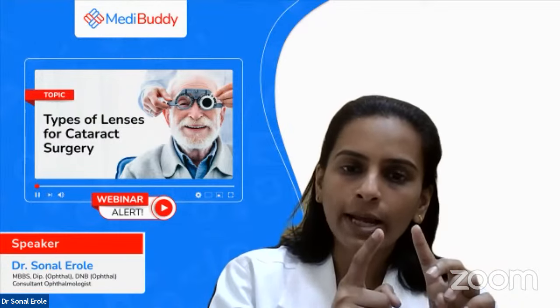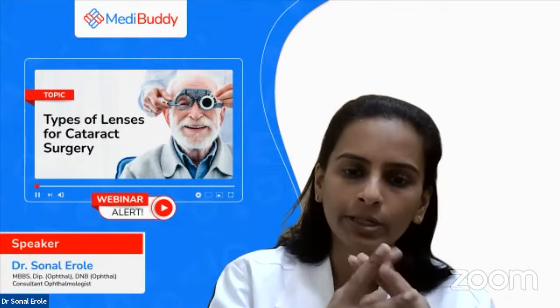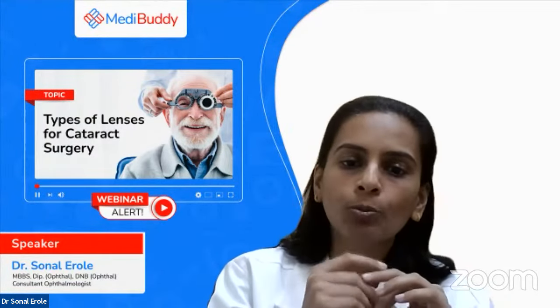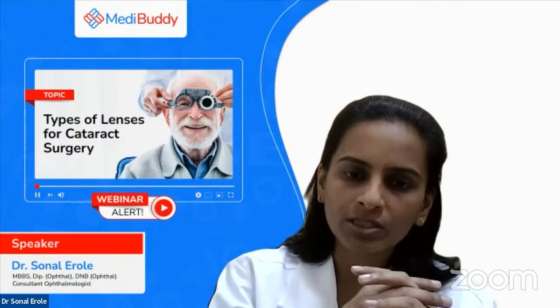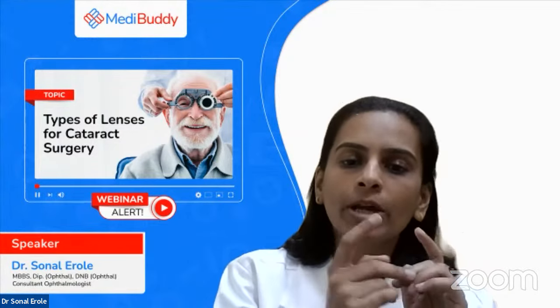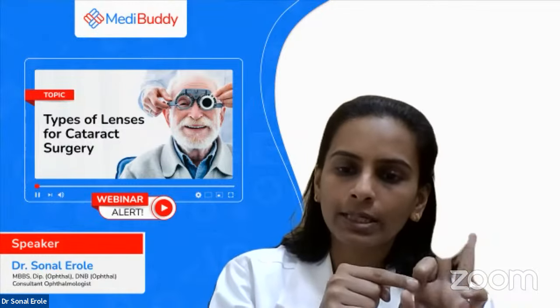Pre-operatively, whenever we are calculating the IOL power, we look at the keratometry readings. If these keratometry readings are more than 1.5 to be specific, then we tell the patients to go for toric lenses to have a perfect distant vision, at least with the monofocal toric lenses.